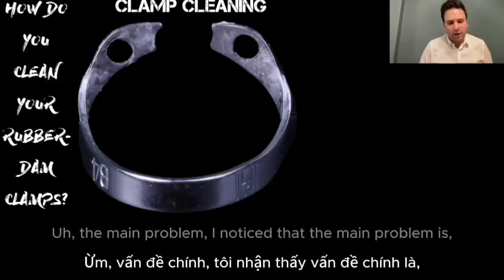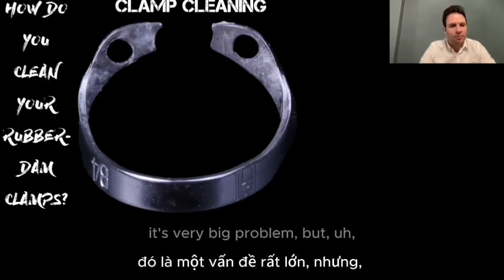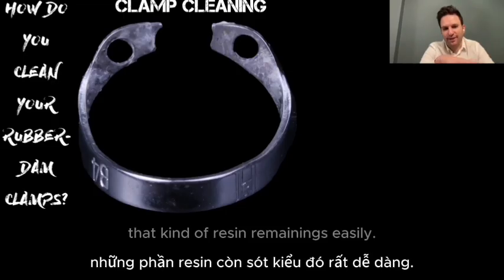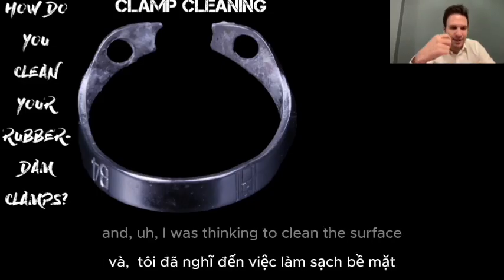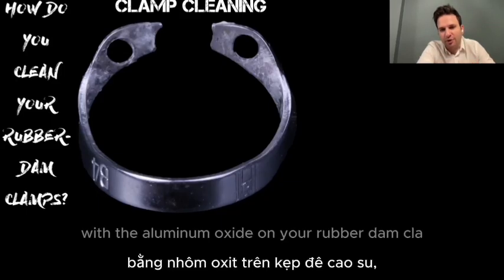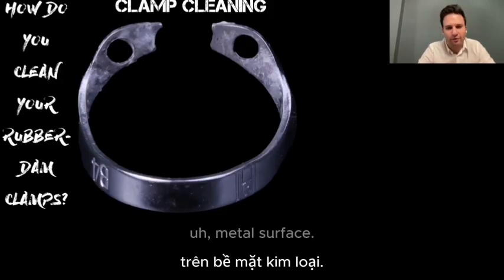After the rubber dam, the main problem I noticed is, especially if you are taking photos, it's a very big problem. But especially if you are taking photos and working under the microscope, you can see that kind of resin remainings easily. So I had a bit of an obsession, and I was thinking to clean the surface of the rubber dam clamps. It's a very big problem if you are using air abrasion with aluminum oxide on your rubber dam clamp, because it directly makes scratches on the metal surface.